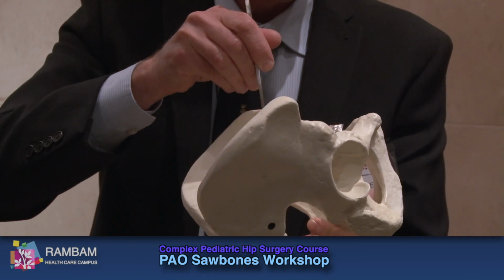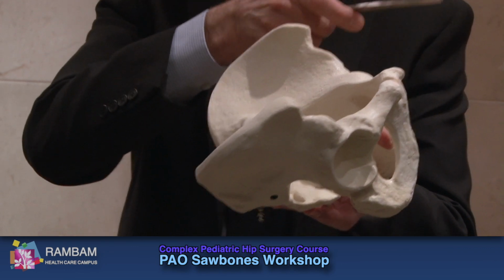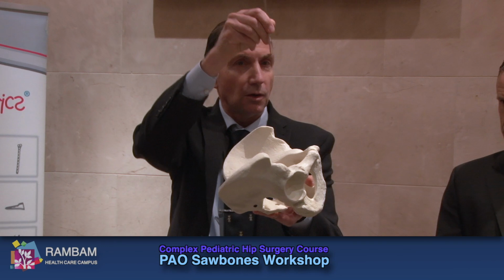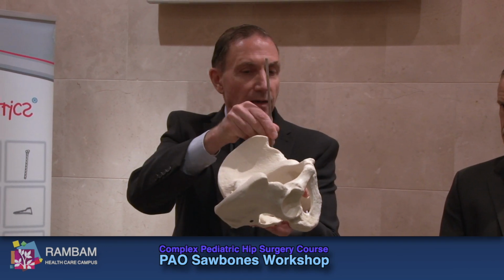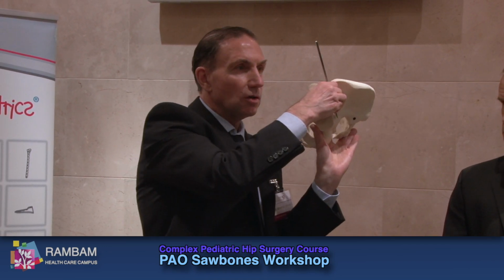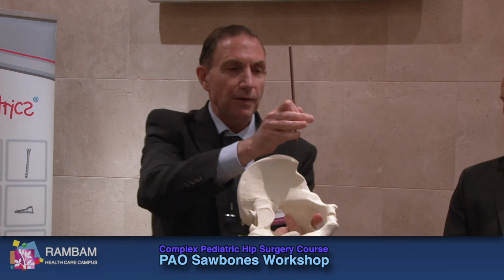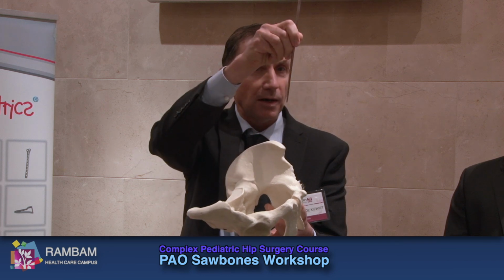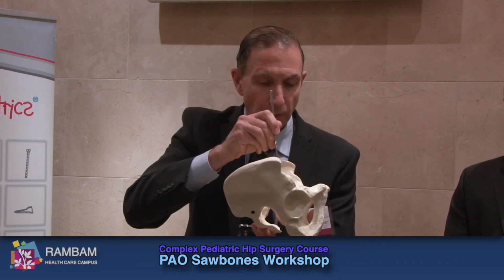Towards that point. And you notice that my acetabulum is at that angle. That's the orientation of my acetabulum. So that's going to be the orientation of my osteotome as well. Not straight, because if I'm doing straight down, I'm approaching the posterior edge of the posterior wall. So I want to curve that a bit like that. Alright? So that's the orientation of my osteotome as well. Going straight down towards that point.